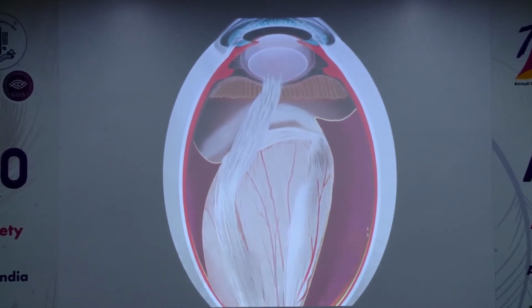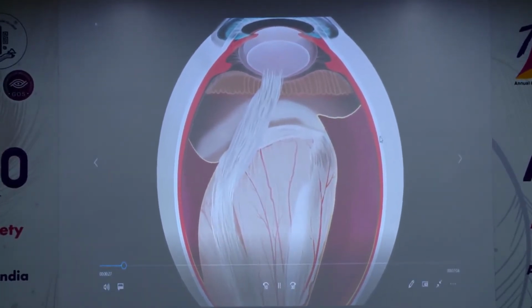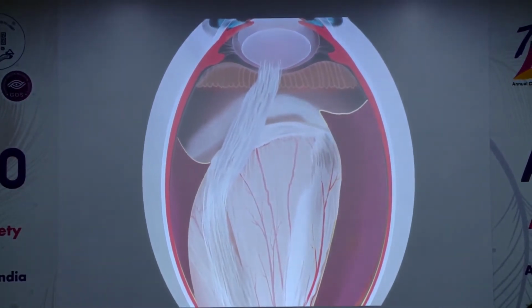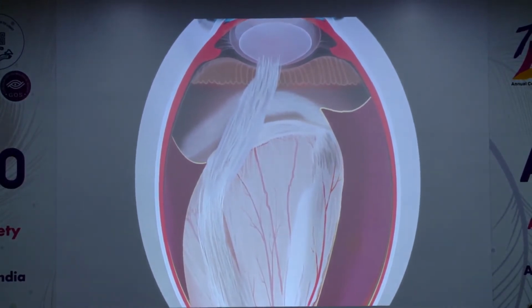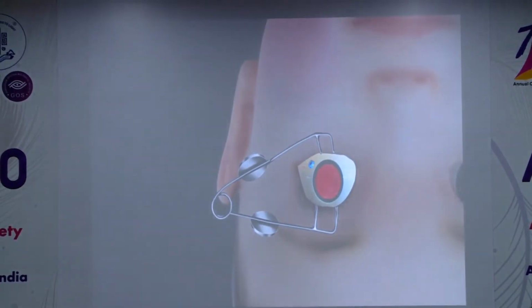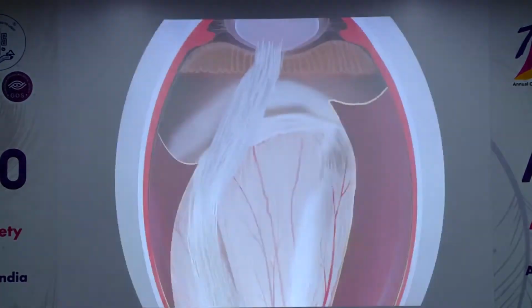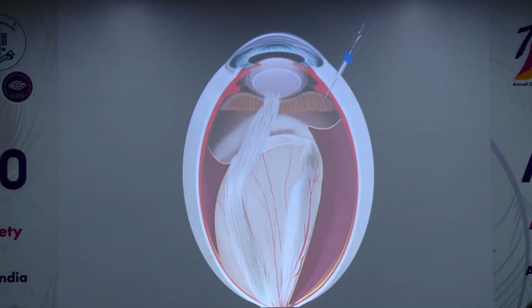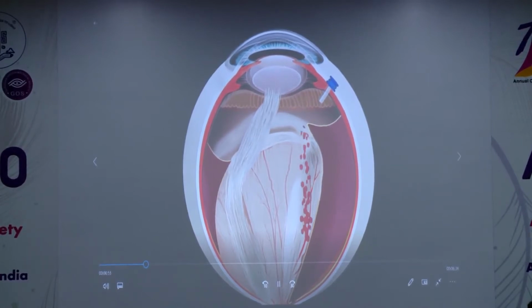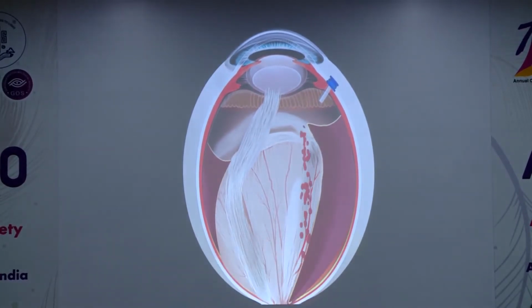A large number of stage 4B ROP cases have extensive detachment of the temporal retina, which in some cases approaches the retrolental space. A conventional approach to vitrectomy requires 2 of the 3 sclerotomies to be placed in the temporal half. In cases with stage 4B ROP, this endangers hitting the lifted temporal retina, and a more horizontal approach would necessitate a lensectomy, thereby taking away the advantages of lens-sparing vitrectomy.